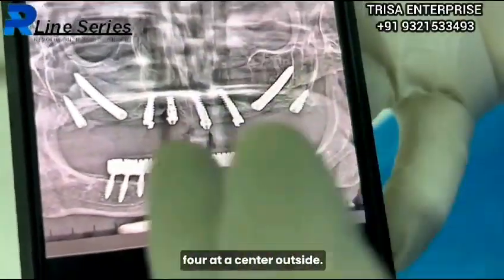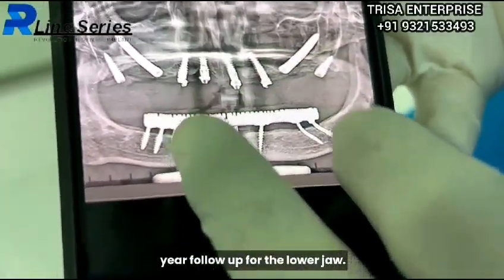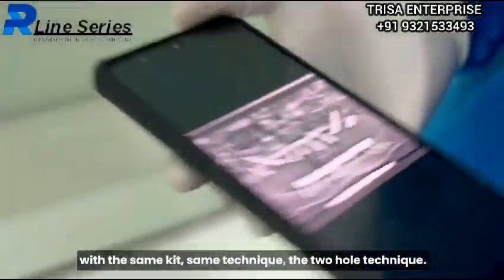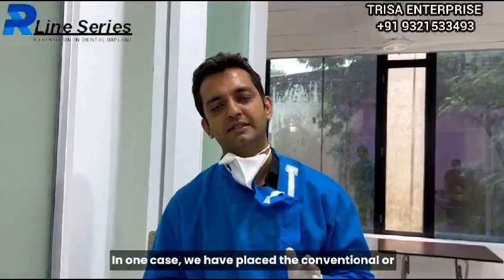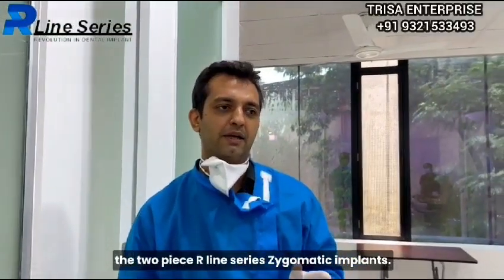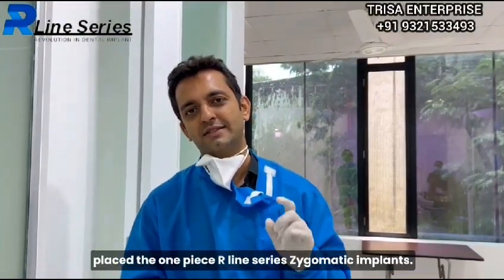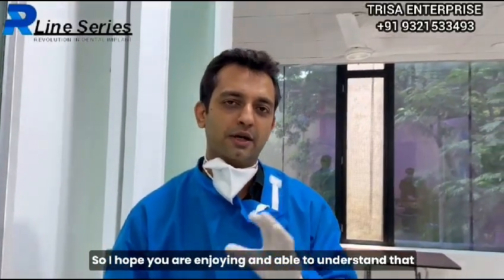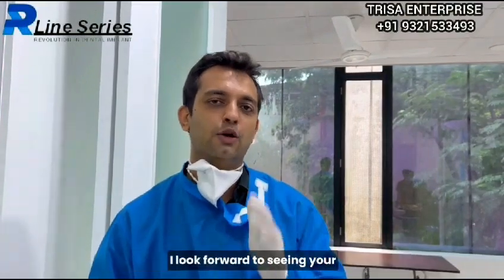This patient had undergone All-on-4 at an outside center and had a problem, so this is almost a 2.5-year follow-up for the lower jaw. Right now let us focus on the upper jaw, where with the same kit and the same two-hole technique, in one case we placed the conventional two-piece R-line series zygomatic implants, and in the other case I placed the one-piece R-line series zygomatic implant.